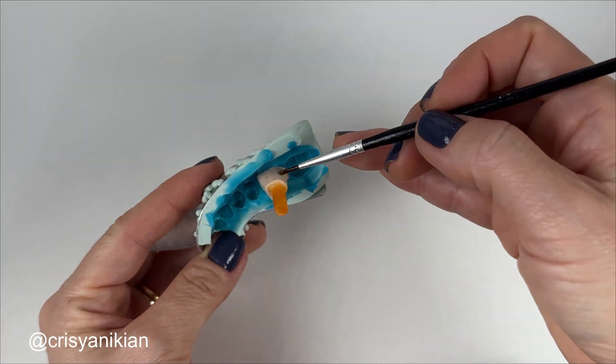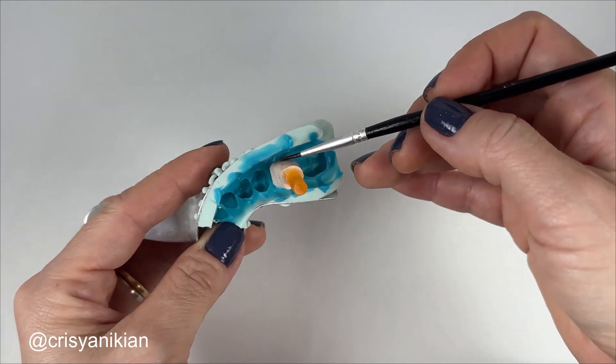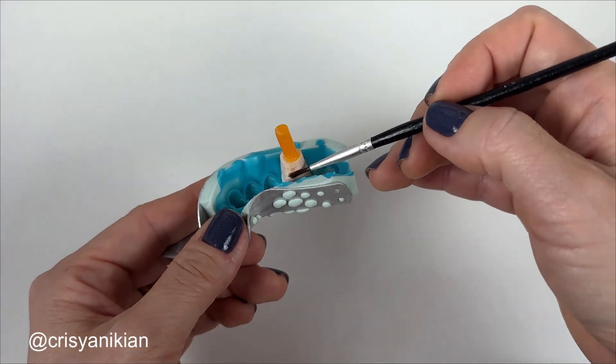Now apply a plaster isolator all around the die using a soft brush. This isolator will prevent the die from adhering to the cast.